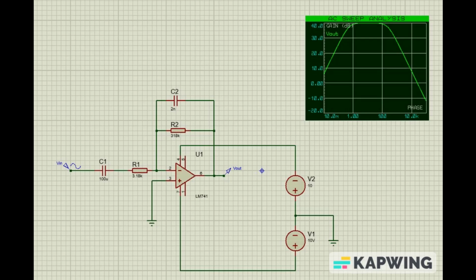So this factor becomes 100, and the gain in terms of decibels is calculated as 20 times log of V out over V in to the base 10. If we calculate this, we get 318k divided by 3.18k, it becomes 100, and 20 times log of 100 to the base 10 becomes 40 decibels, as we can see from the AC sweep analysis.